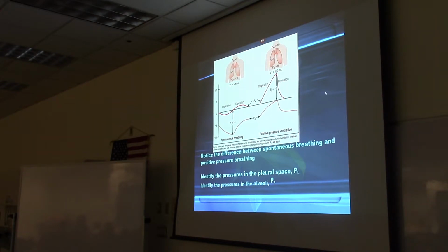Negative 10? Do you see how you have to look on the x-axis, y-axis, I'm sorry, and it's minus 10. And what is it for a positive pressure breath? The pressure in the pleural space. Yeah, approaches 0.